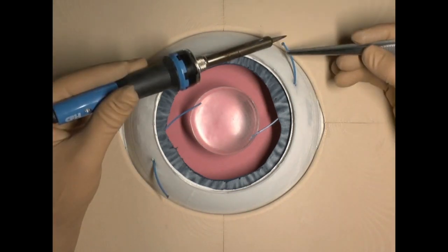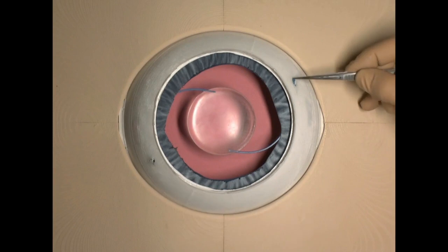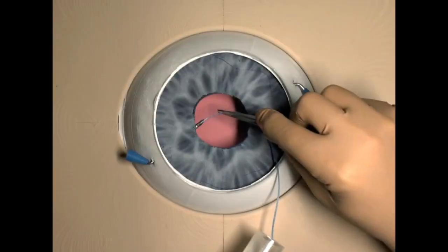Enlarged tips of the haptics are then inserted inside sclero-tunnel. Manipulation with the haptics is not simple.